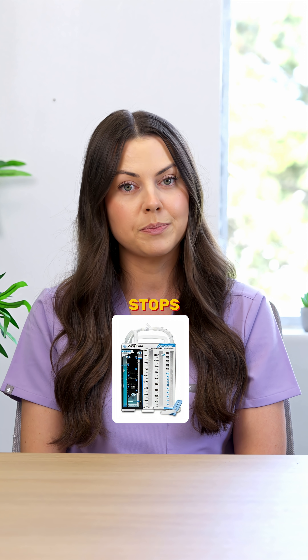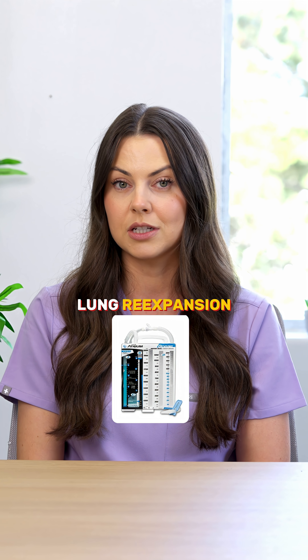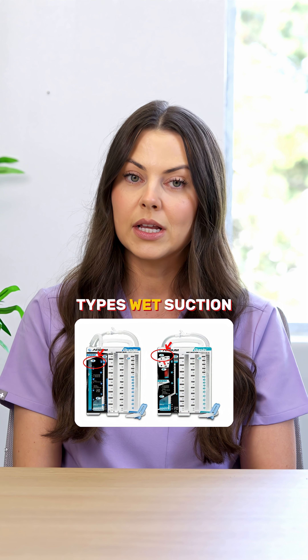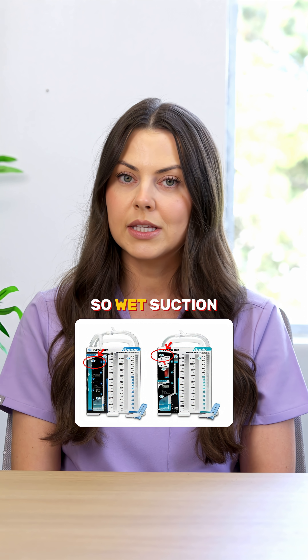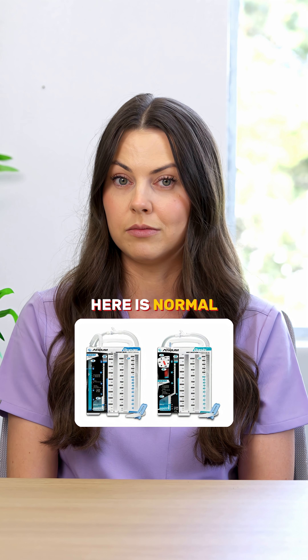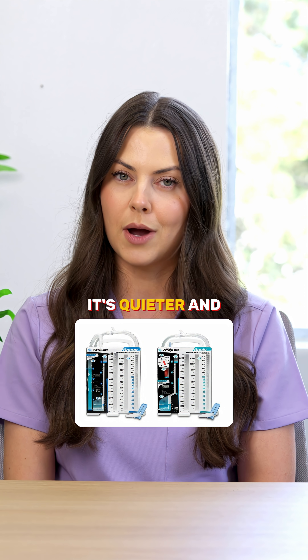And if the tidaling suddenly stops, check for a kink, a clot, or lung re-expansion. When it comes to suction control chambers, there are two types: wet suction and dry suction. Wet suction uses sterile water, and gentle bubbling here is normal. Dry suction uses a dial to control the suction — it's quieter and more accurate.